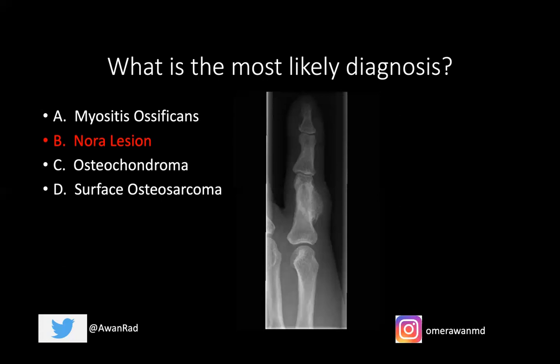An osteochondroma would be a consideration — it's a benign cartilaginous tumor — but a couple of things argue against it. First, this is not metaphyseal; it's more diaphyseal, maybe metadiaphyseal, but certainly not purely metaphyseal. Another characteristic of osteochondroma is that they usually point away from the joint, but this is neutral in position. Most importantly, there's no medullary continuity with the bone — an osteochondroma always has medullary continuity. Here it's coming directly off the bone with no continuity, making osteochondroma much less likely.